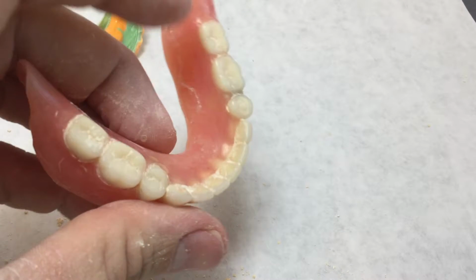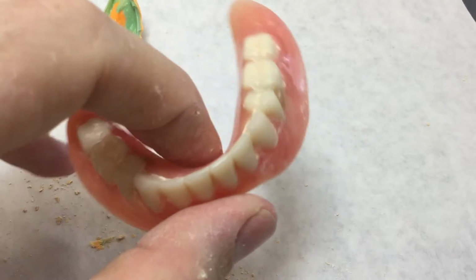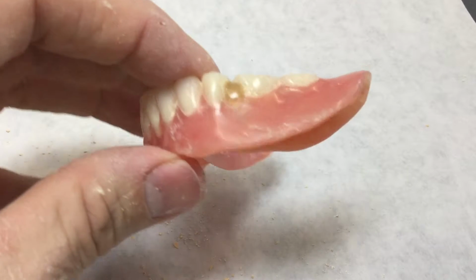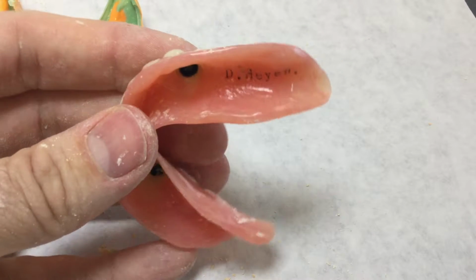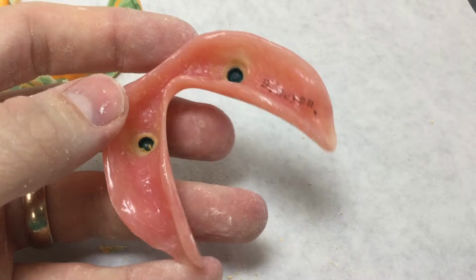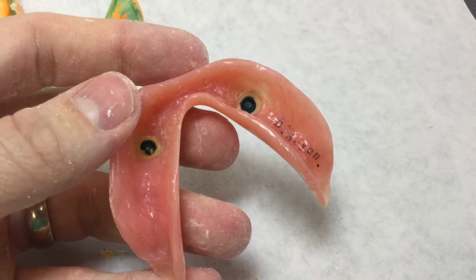Finally, the patient's denture must be borrowed so a duplicate can be produced as a radiographic guide. The lab can generally return the denture within 24 hours since they only need the denture during the setup and flasking portion of the radiographic guide fabrication.